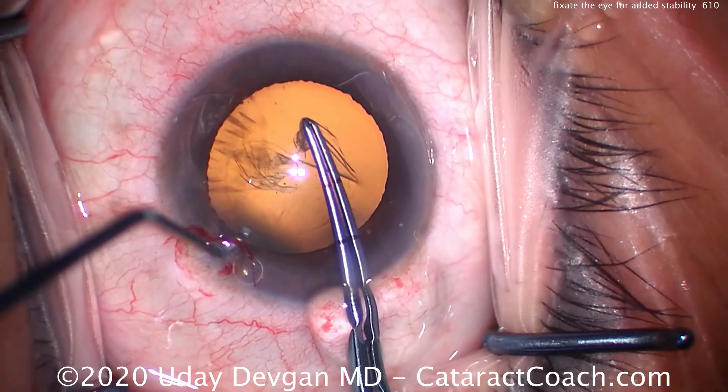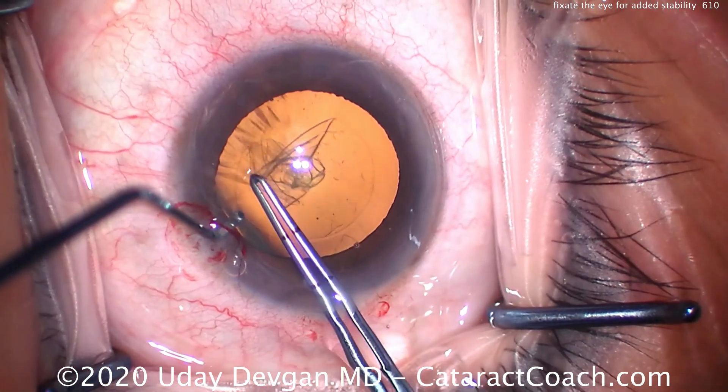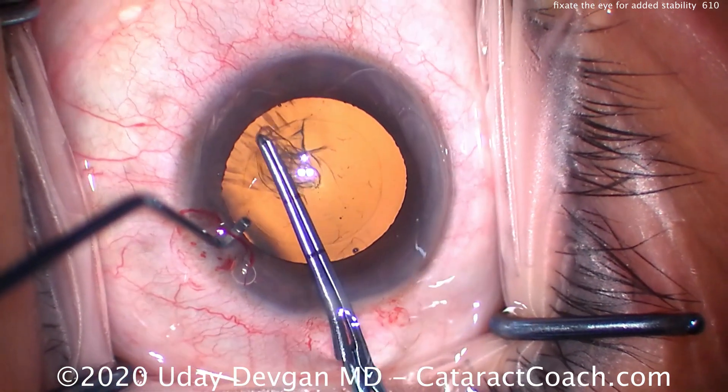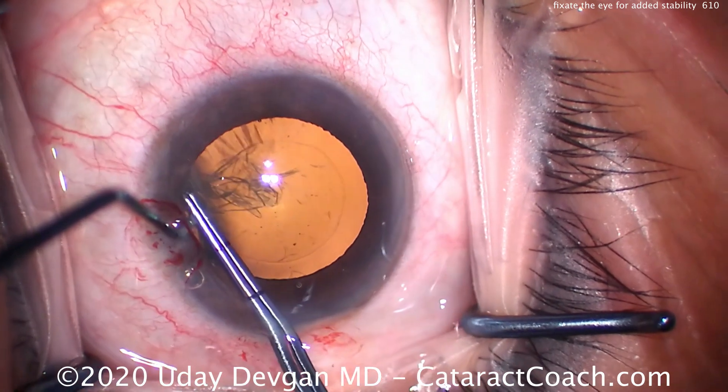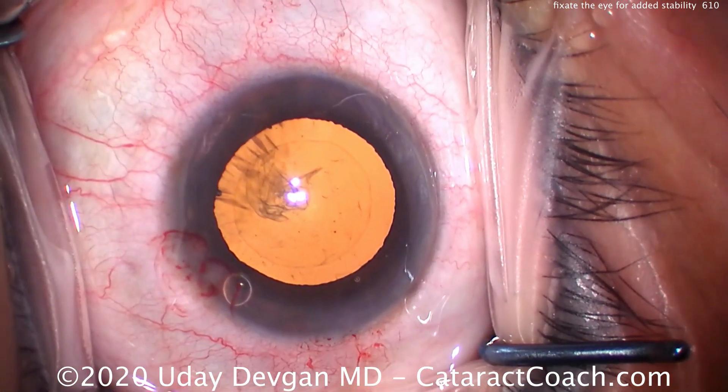You can see we have a lot of great control. The left hand is holding the eye completely still, and the right hand is using the forceps. This is why you need to be able to do a one-handed technique for capsulorexis. The forceps are just held in one hand — and we're done, and that looks great.